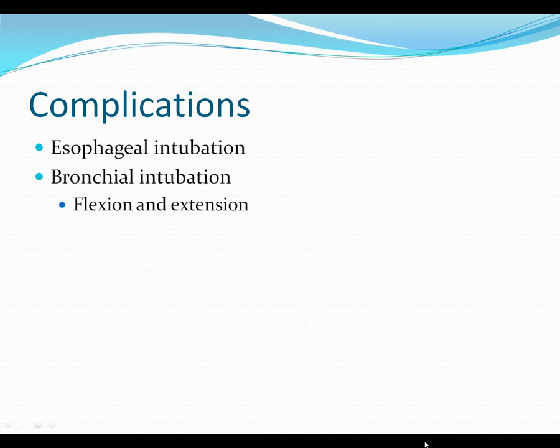All right, esophageal intubation or a bronchial intubation. I think we talked about esophageal intubation. Anyone done that? I think we all have. So you put the tube in and it doesn't feel right when you squeeze the bag, you don't see CO2, there's no exhalation in the self-inflating bulb, or you don't get much exhalation. So you squeeze the bag and nothing comes back, and the chest wall isn't moving, and you might hear some gurgling. It just doesn't seem right.